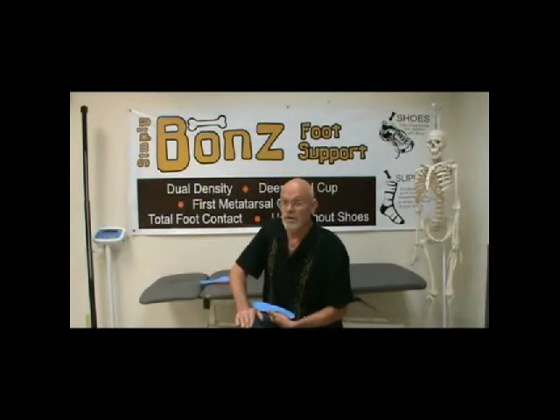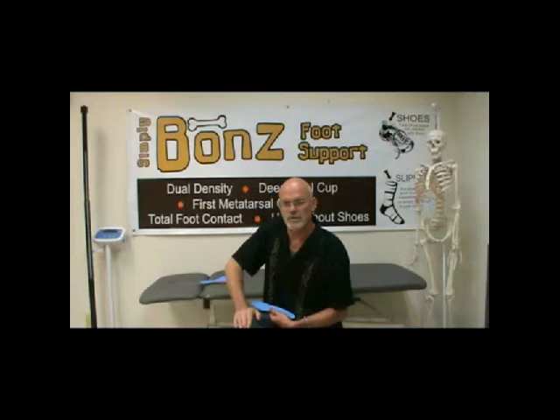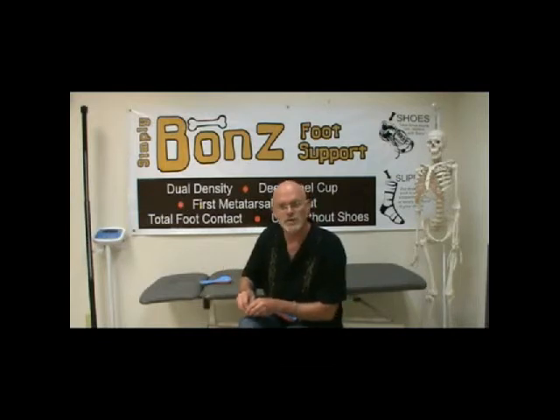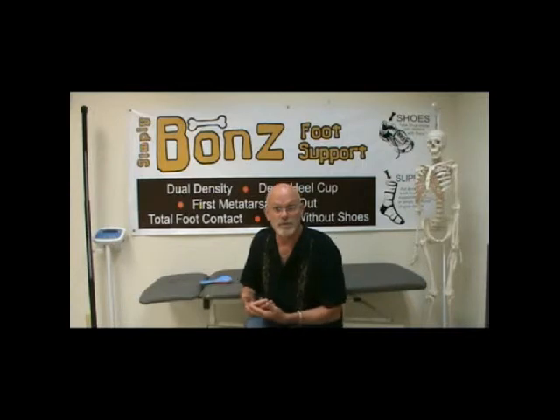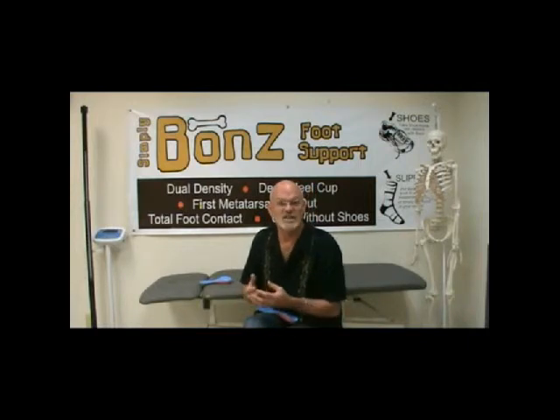Same amount of force though, 2 pounds, using one finger, well, that's a lot of pressure. But the force is the same, okay? This is 2 pounds and this is 2 pounds. The difference is here, that 2 pounds is spread out, and here it's all concentrated in one spot. So if our goal is to reduce pressure under your foot, we don't necessarily need soft materials, although that feels good. We need materials that touch as much of your foot as we can. We need a design of total contact.